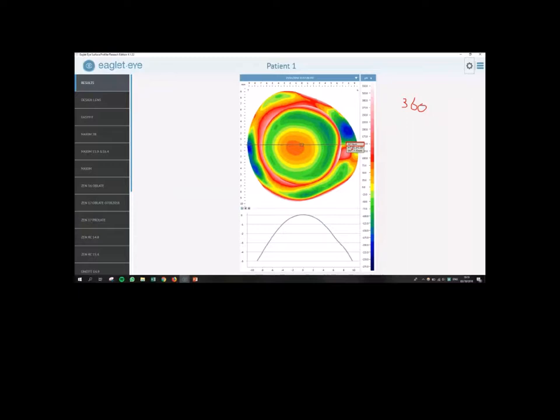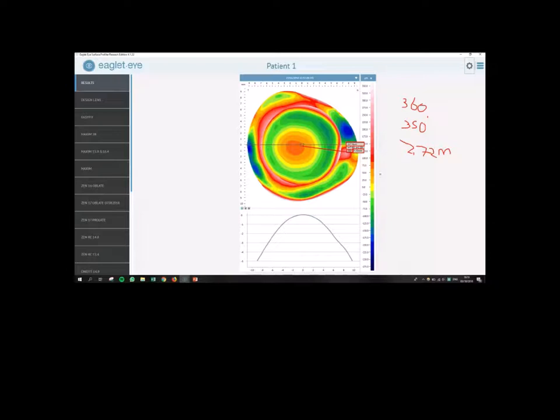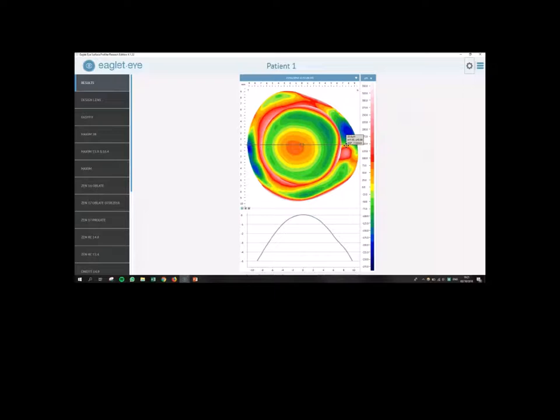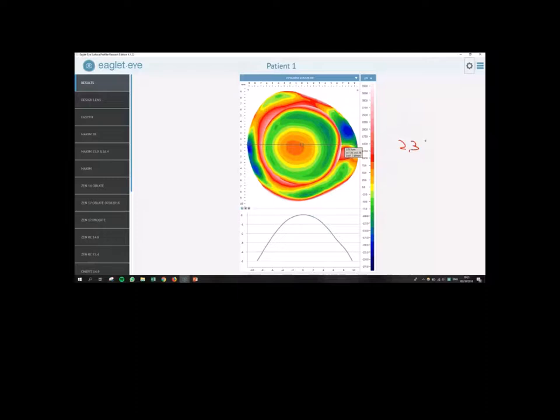The other thing we want to know is how far is it away from the apex? So that's located next to the axis. It's 7.72 millimeters away from the apex. So there's only one thing that I want to find out now. And then we have all the information that is the width of this pinguecula. So to do that, unfortunately, I have to start moving my mouse a little bit. So I'll delete this screen. If you go all the way at the top, I'm going to look at the y value right now. So over here, that's 0.09. I hope you can read my bad handwriting. And if I move it all the way at the bottom, I'll lock my screen again for you. It's 2.30. Let's make it 30. So that means in this case, I want to start ordering a microvault with a width of 1.40 millimeters.